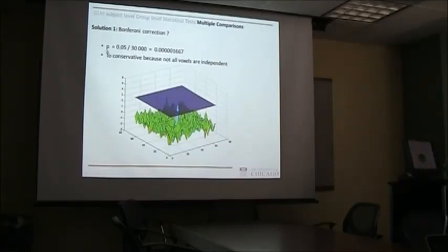However, in MRI, this is just not feasible, because if you would divide that, your p-value has to be something like this in order to become significant, and that hardly ever happens, right? Because you get some crazy low p-value that's just not realistic to observe. In other words, you would need a huge effect size to declare something significant.